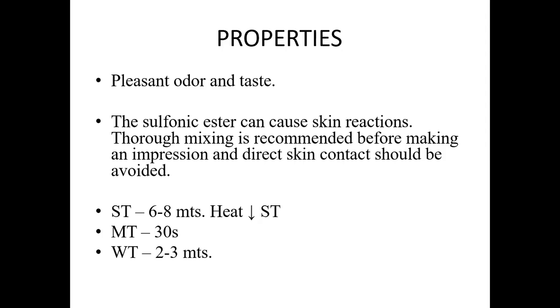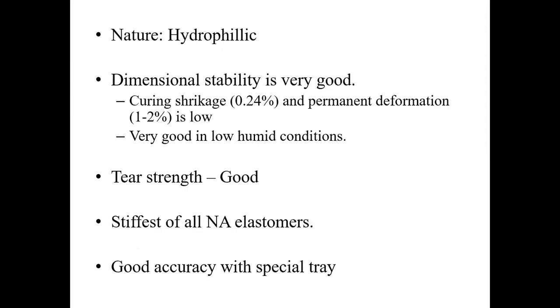Coming to the properties, this material has a pleasant odor and taste, and it has sulfonic ester in it, which can cause skin reactions. So, thorough mixing is recommended before making an impression, and direct skin contact should also be avoided. The setting time is 6 to 8 minutes. The mixing time of this material is 30 seconds, and the working time we get is 2 to 3 minutes.